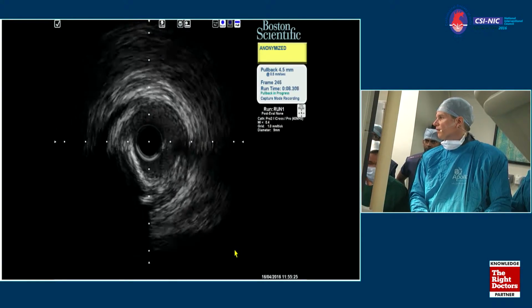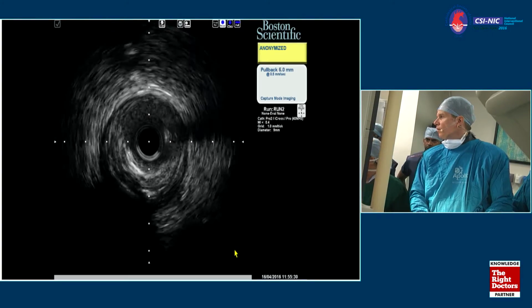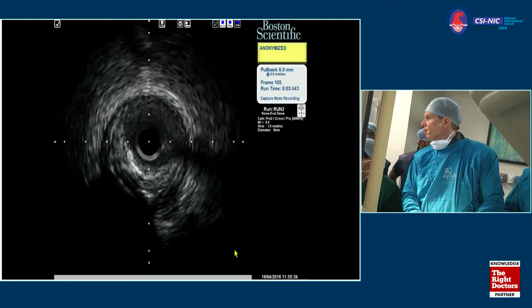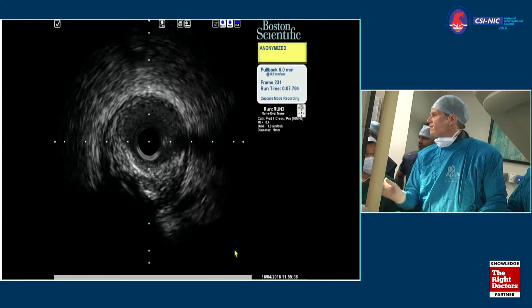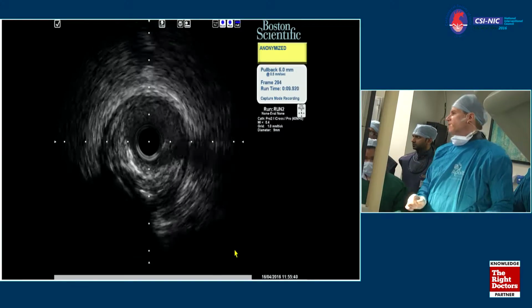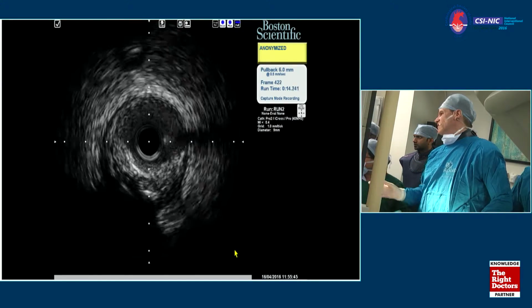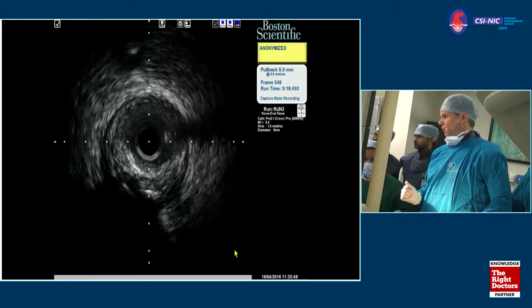Yeah, I tried to show you the proximal. It's 3.5. You see the IVUS, yeah? Yeah, we are seeing. 3.5 to 4 almost. A lot of plaque. Please go in this. Yeah, there's a lot of plaque. We will take at least a 3.5, maybe even 4. It's 4. I would take a 4. Nearly 4. After IVUS, I would take a 4.